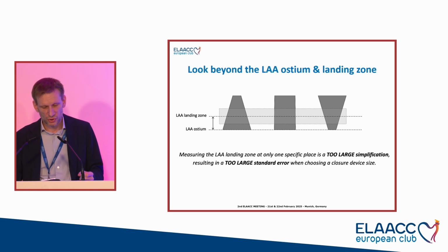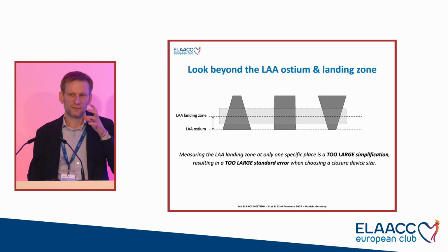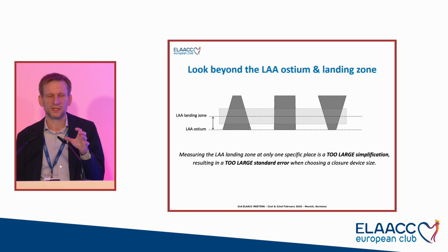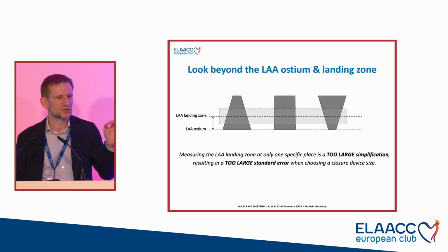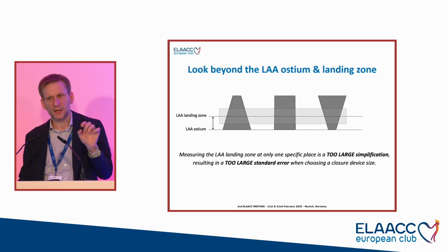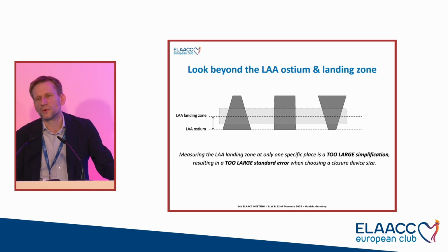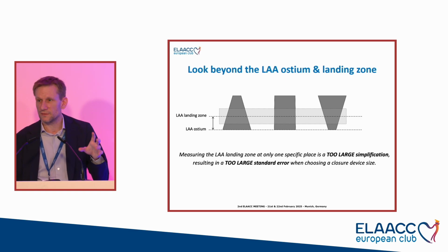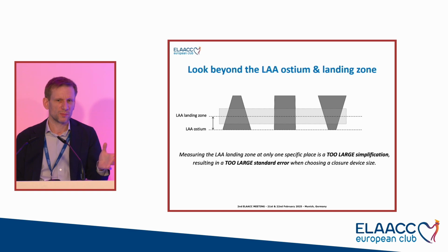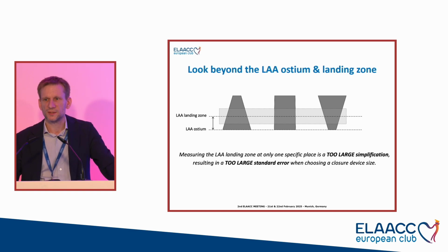And then also, intra-procedurally, I think you really have to try to envision where the device will come to sit. It's not simply pulling a line at the ostium and then a line 10 millimeters down, if you work with an Amulet, or a line at the landing zone. It doesn't work like that. You have to try to envision where the device comes to sit, and make some additional measurements a bit deeper, a bit more proximal. So it's more fine-tuned than just these single recommended measurements.